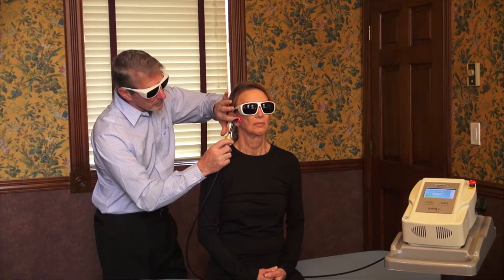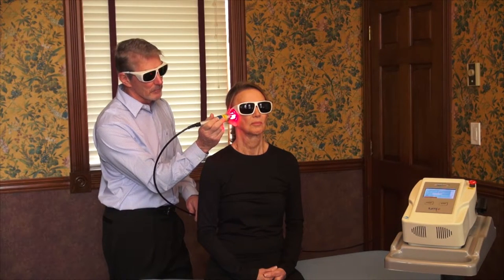For the muscular component, the myofascial component, a broader tip is needed. However, with the TMJ structure itself, I can specifically focus on the joint with the dental tip — though heat must be controlled because the beam is narrower and more focused. If I'm working with TMD and want to treat that structure, it is easier to use the general aperture, dialed to a narrower beam to stay focused over that joint. If I want to work with the temporalis muscle, I spread the beam to cover more of the muscle.